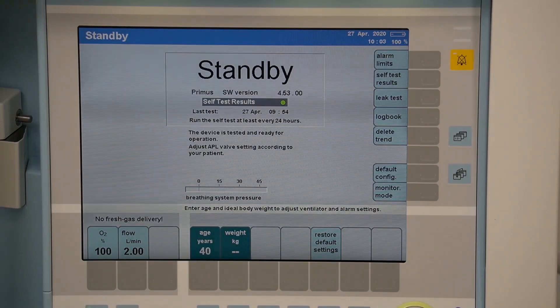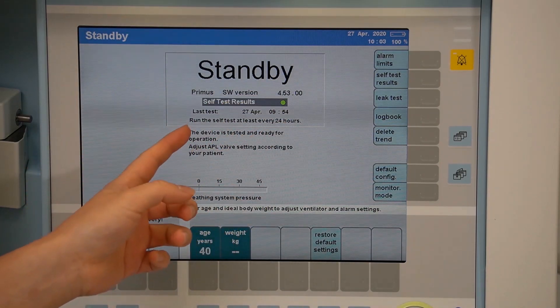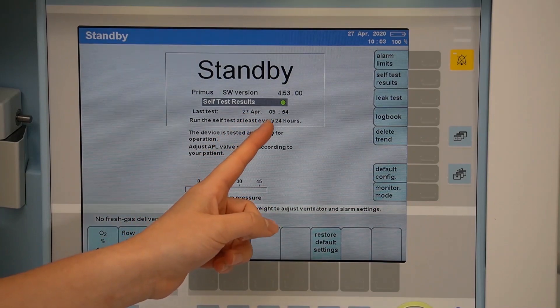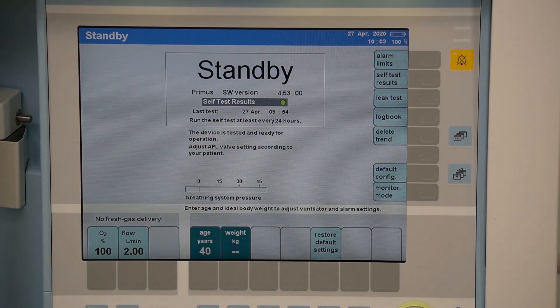Once the system test has been completed, the device will return to the standby screen. The self-test results will be displayed here with a date and time stamp. Green indicates a fully functioning device. Yellow would indicate a device with some restrictions or limitations.